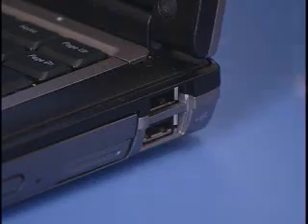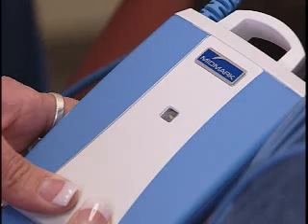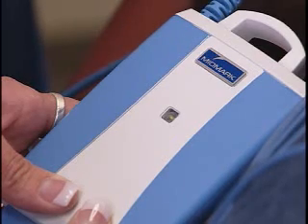Connect the USB or serial end of the IQecg cable into the computer and check that the green LED light is on, indicating that the device has power. To prepare for an ECG test, your patient must be undressed from the waist up. For female patients, ask them to remove their bra and wear an exam gown so that it opens from the front.